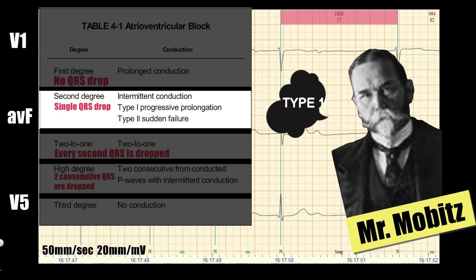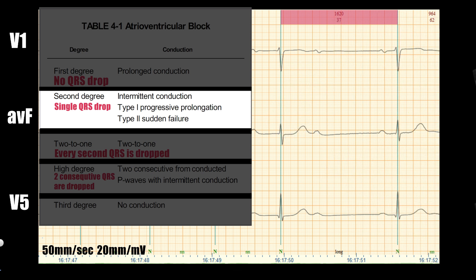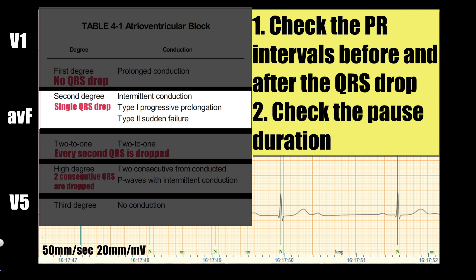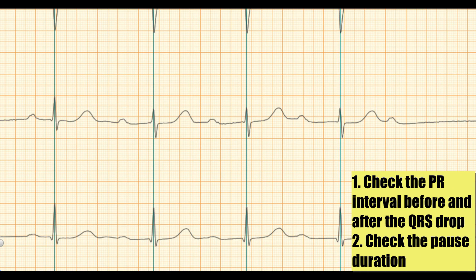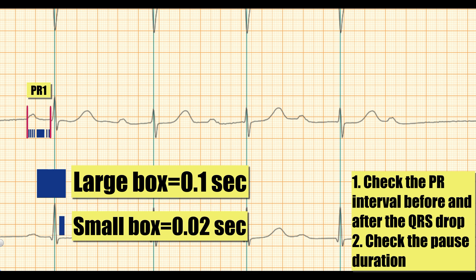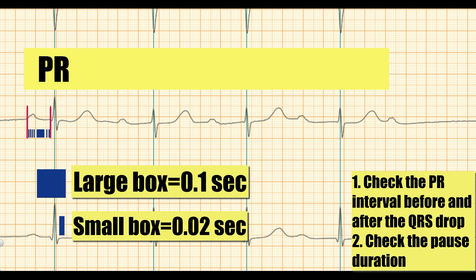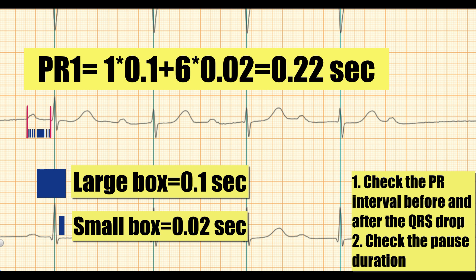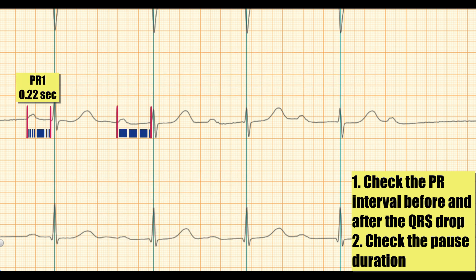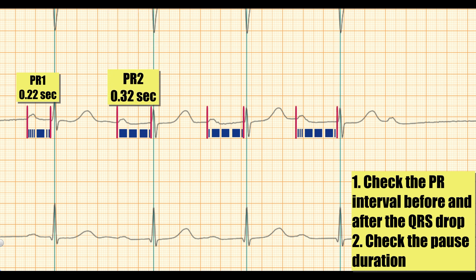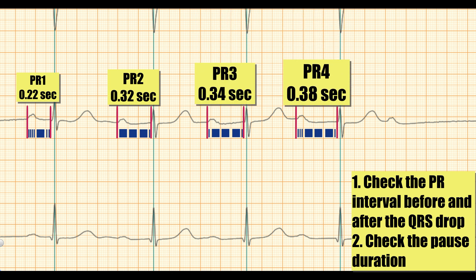2nd degree AV block can be Mobitz 1 (type 1) or Mobitz 2 (type 2). To distinguish them, we check the PR interval before the drop and the first PR after the drop, plus the duration of the pause. The first PR interval consists of one large box and six small boxes, equaling 0.22 second. The second PR equals 0.32 second, the third 0.34 second, and the fourth 0.38 second.